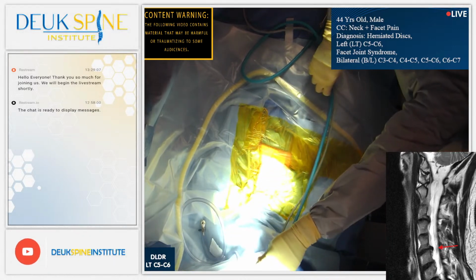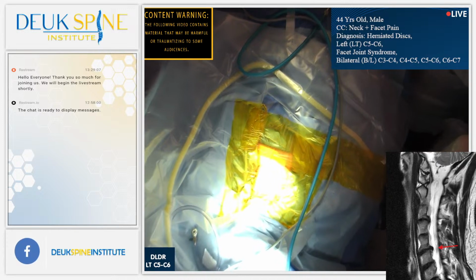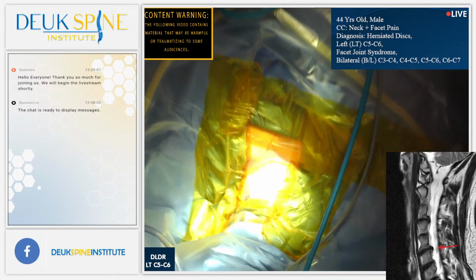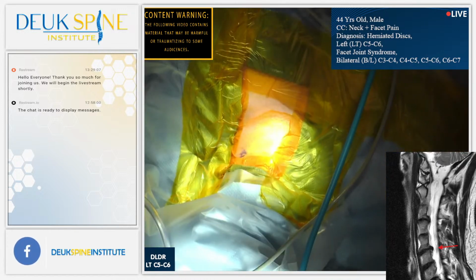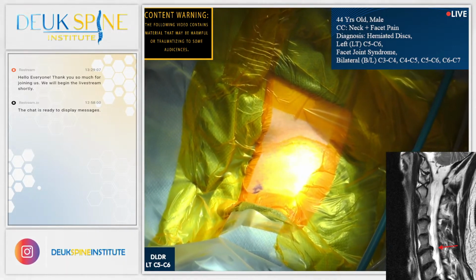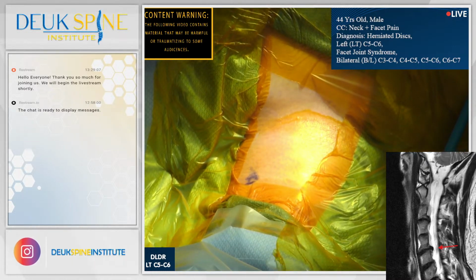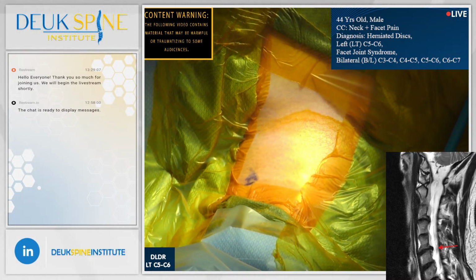This patient comes from Canada. He has horrible neck pain for 10 years. We've just finished doing his cervical facet Duke plasma rhizotomy, to kill the pain nerves in the back of his neck causing pain. We're now going to fix one disc that is herniated, causing his symptoms. That is number 5-6. Everybody agree, 5-6? Yes, left approach, we're on the left side. Okay, we're ready to get started.